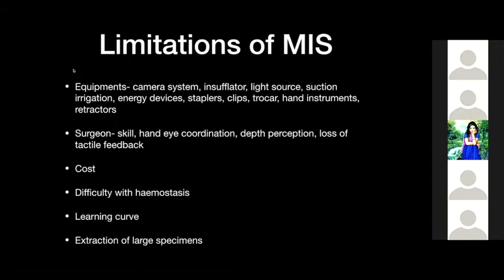So if you have no access to this kind of devices, then obviously you will have limitation to even begin doing laparoscopic work. Forget about doing more complex surgeries. Okay, so basically you may need a mixture of all of them or some of them to be able to do some form of laparoscopic surgery. But as the higher you go up the pyramid and the more complex the surgery gets, the more advanced instruments may be required.